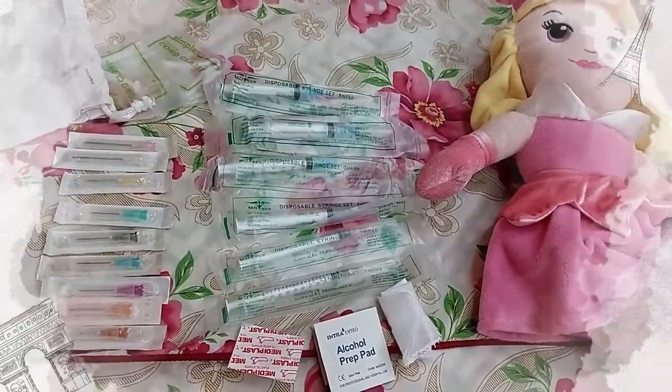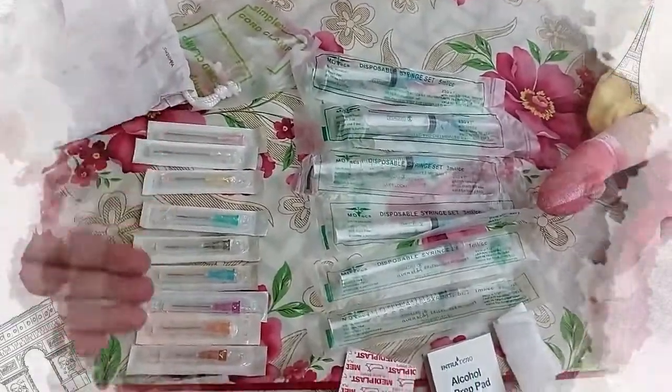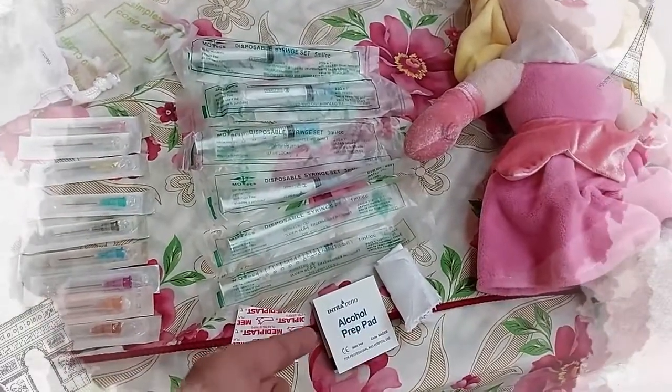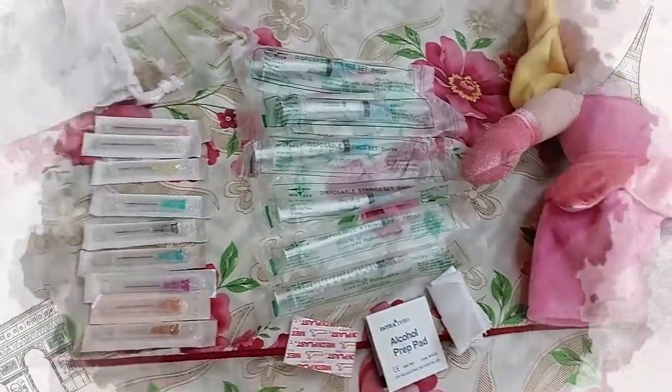Now I'll be showing you the injection materials that I'll be needing. These are my injection materials: all my needles of different sizes, all my syringes of different sizes, my bandage, alcohol prep pad, and a cotton ball.